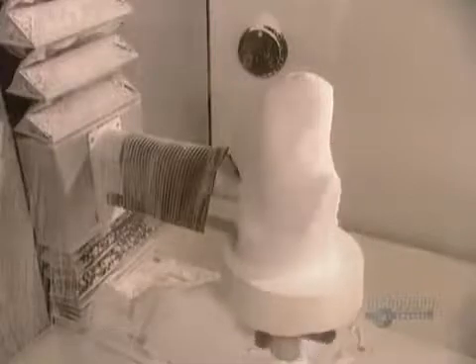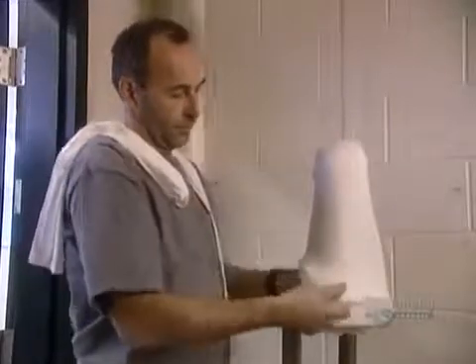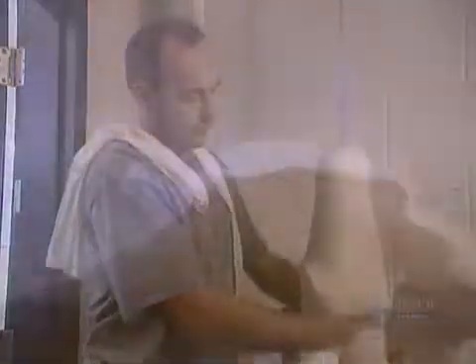With either technique, once the positive mold is ready, they can make the artificial limb. The process they use is called lamination. First, they cover the mold in fabric socks — some made of nylon, others of a material that contains fiberglass. They layer six to ten socks in all, depending on how rigid they want the artificial limb to be.